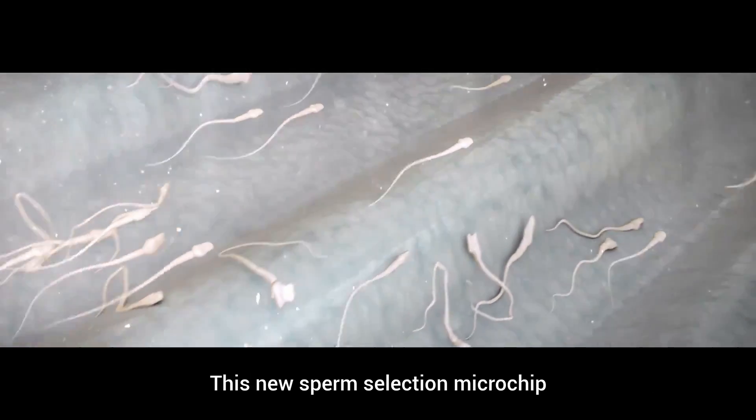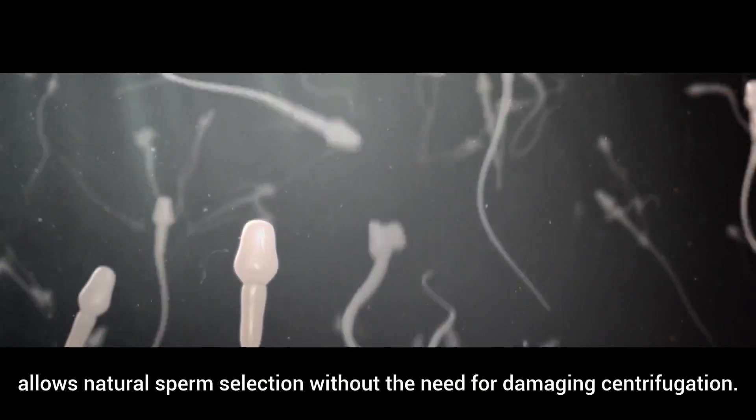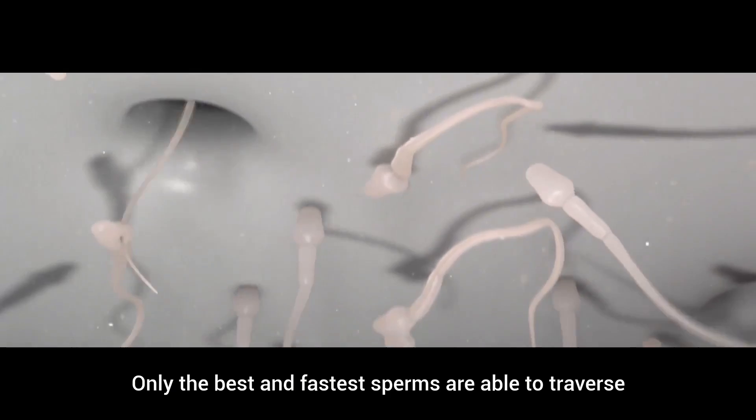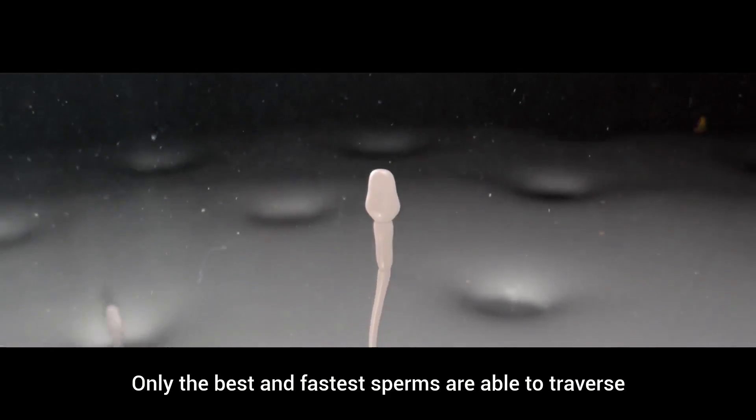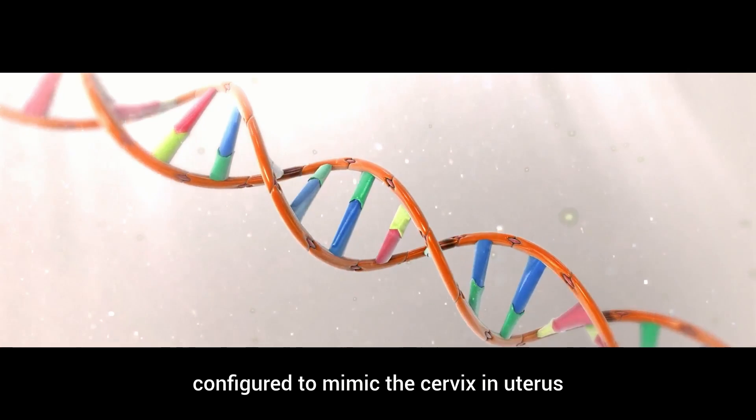This new sperm selection microchip allows natural sperm selection without the need for damaging centrifugation. Only the best and fastest sperm are able to traverse specialized grooves and micropores configured to mimic the cervix and uterus.